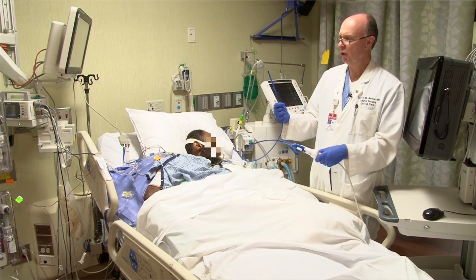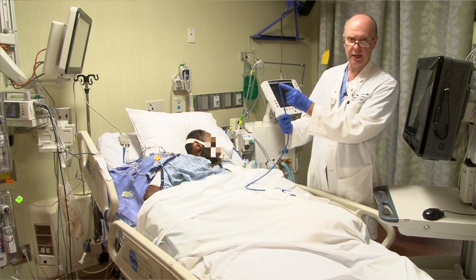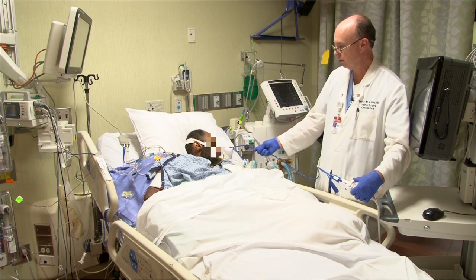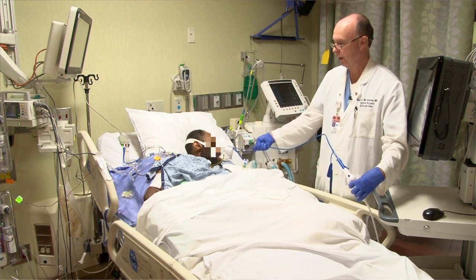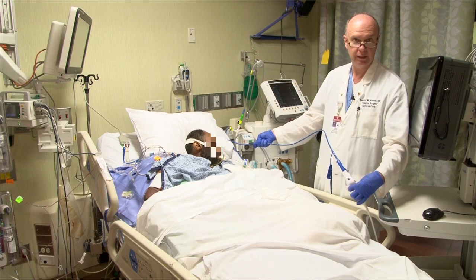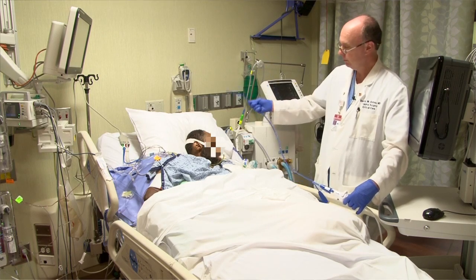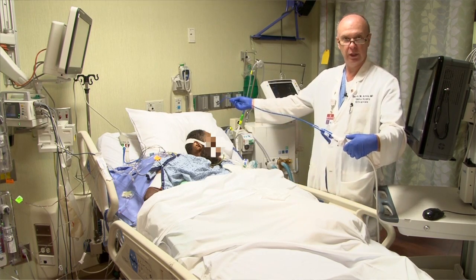Another thing to notice about the probe — you can see the very tip of the probe here, the shiny segment of the distal end. This is actually the ultrasound transducer, and that's the way we want to insert the probe. We do not want to insert the shiny part of the transducer pointing up toward the head, because that will just make us have to flip or rotate it 180 degrees once we're in the esophagus. So we want to start with the transducer pointing down toward the tongue, and that will be lined up appropriately with our handle.